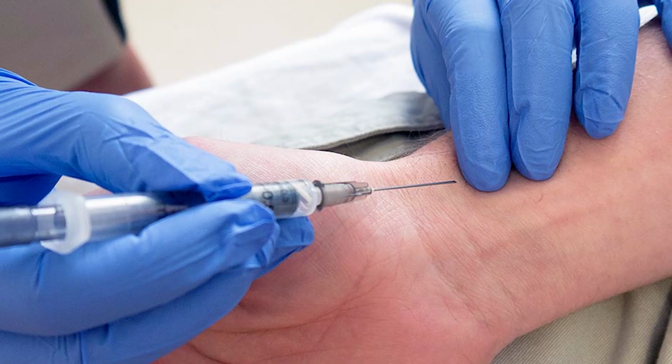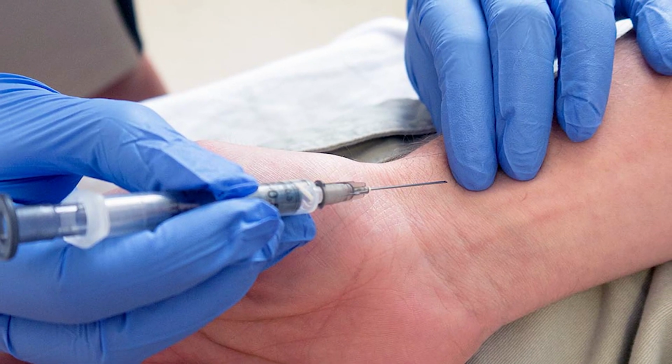And right now, I can't see you guys, but if you're not breathing hard, and I could assume that you're not COPD, if I said, what's your CO2 value? It's 40. However, if I were to check a blood gas on you, I might not get exactly 40. I might get 34 on one of you and 42 on another. Does that mean you're 33 or 34 or 42? No, you're actually 40. So why am I getting a different number?